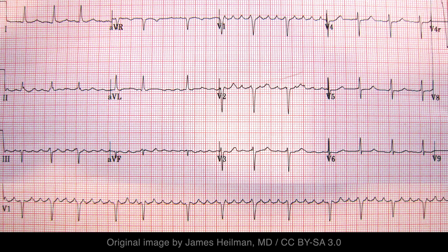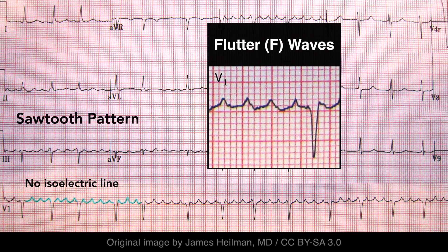Atrial flutter is a macro re-entrant dysrhythmia characterized by rapid flutter waves with a sawtooth appearance. The ectopic atrial depolarizations are called flutter waves — they are not P waves. These flutter waves are usually best visualized in the inferior leads, where they have a V shape. In this case, the flutter waves are best visualized in V1, where they are positive deflections.